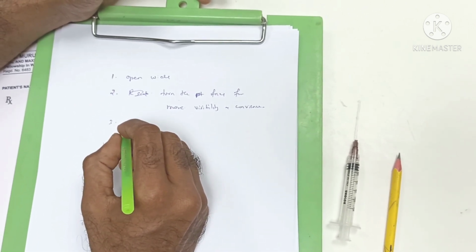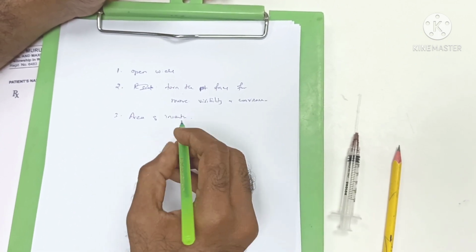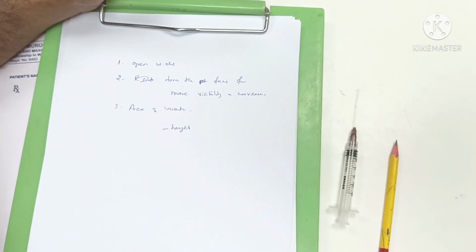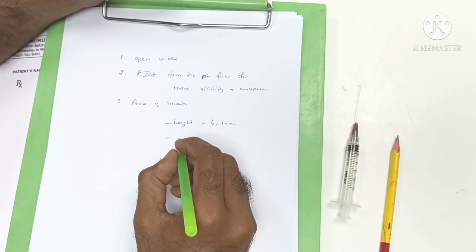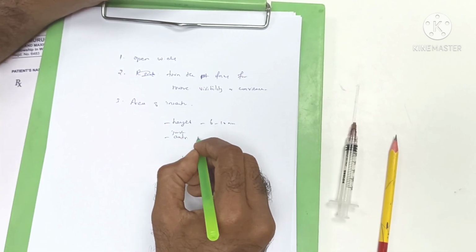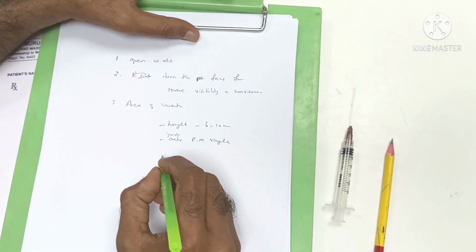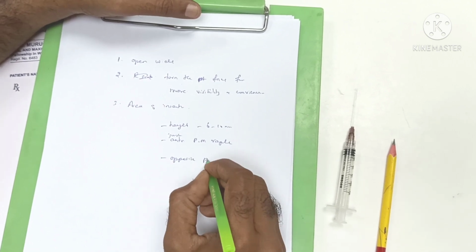The third thing is the area of insertion. There are two things. One is height: 6 to 10 mm above the occlusion plane. Another is just anterior to the pterygomandibular raphe. And start from the opposite premolars.